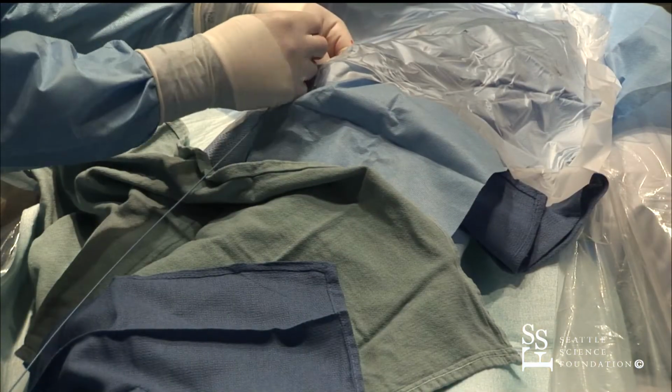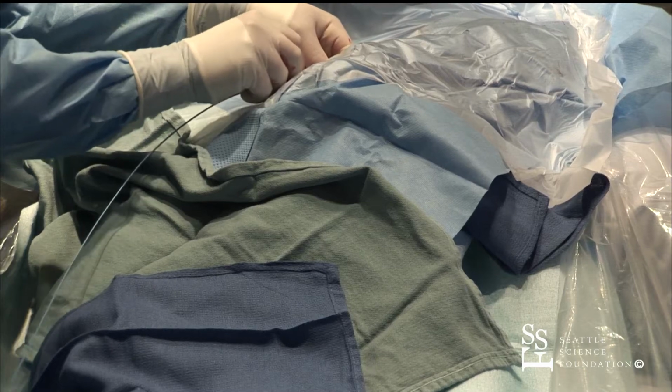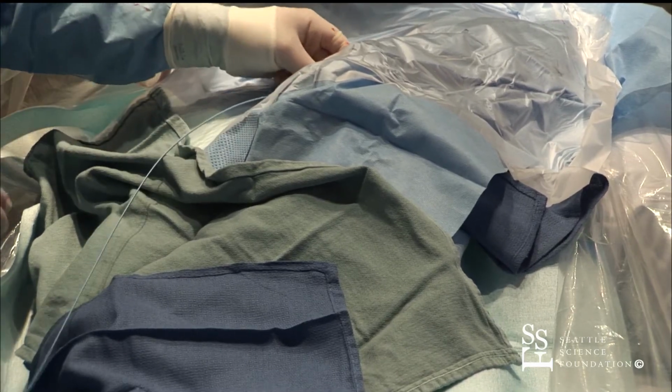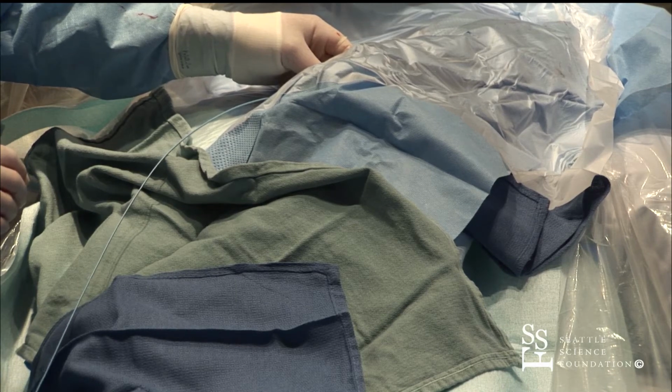Right. And here's a JR4 catheter with a Rosen wire, and then we're going to insert that in. And what I've lately been doing is, I think folks kind of advance it. We just go slow with the wire. You don't want to really ramrod this in until you get beyond the elbow.